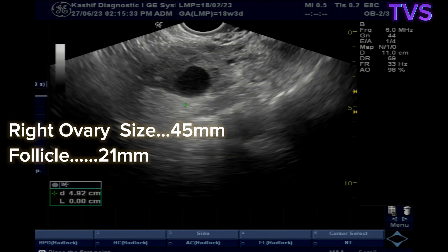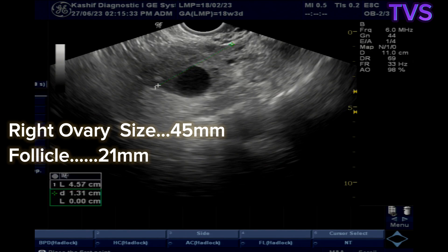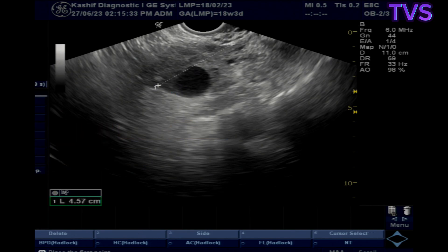The right ovary is normal in size. There is a dominant follicle of 21 mm, which is normal. No fluid is seen in the cul-de-sac or adnexa on the right side.